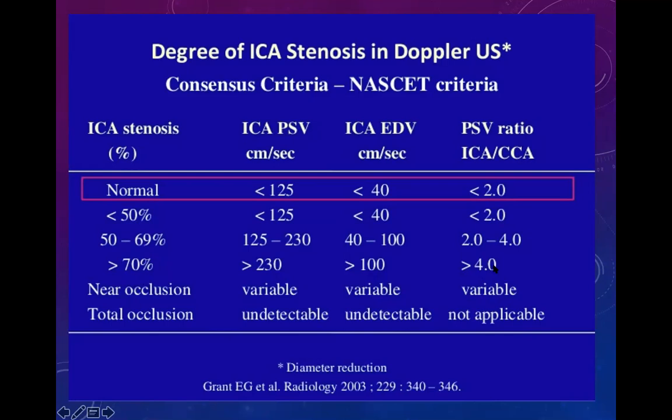So this is the consensus criteria that is followed, while some have also developed their institution-specific criteria, because one should understand by that report what they are meaning. And in the US, I believe, we were talking to Barry Katzen once in Miami, and he said it's now more or less standardized, because it also depends on the machine that you are using, the operator, and the probe that you are using.